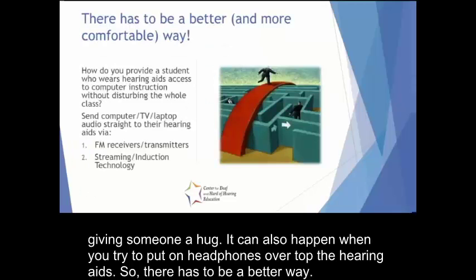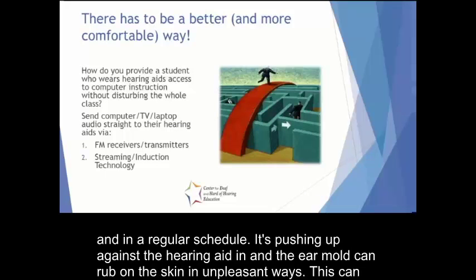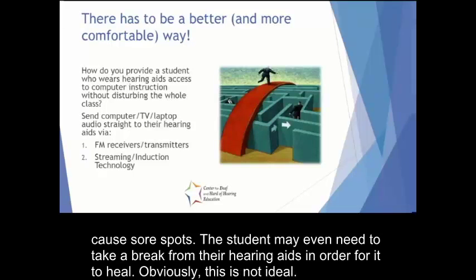So there has to be a better way. First of all, wearing headphones over your hearing aids is pretty physically uncomfortable, particularly if it's for an extended period of time and in a regular schedule. It's pushing up against the hearing aid, and the ear mold can rub on the skin in unpleasant ways. This can cause sore spots.